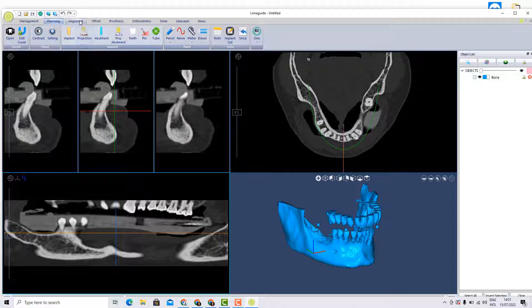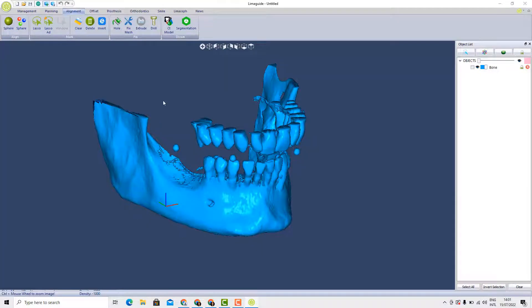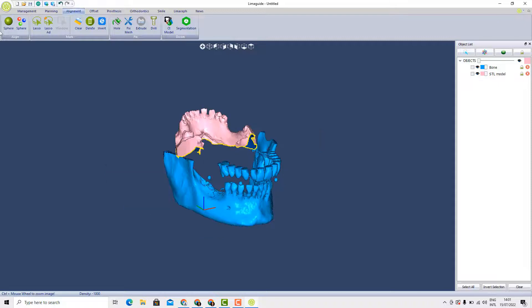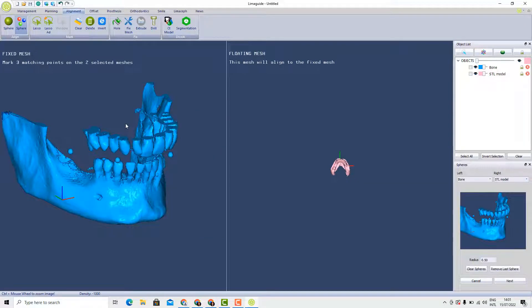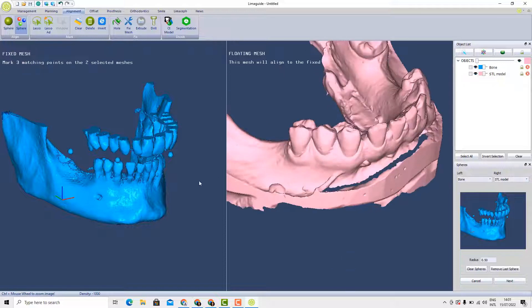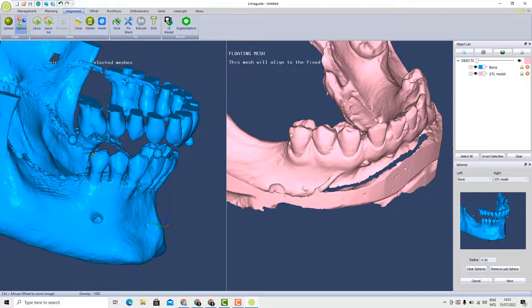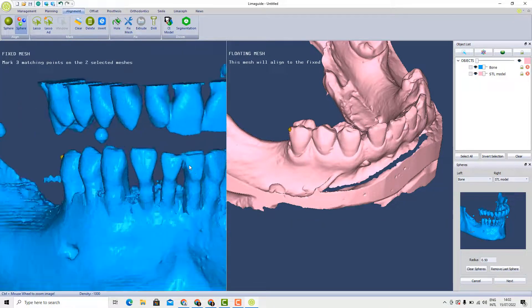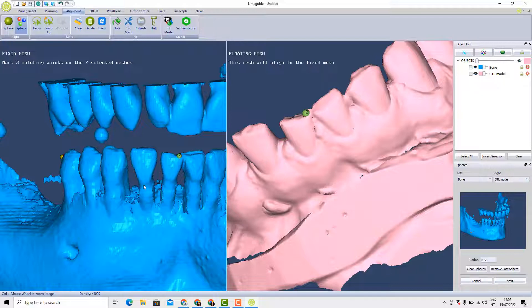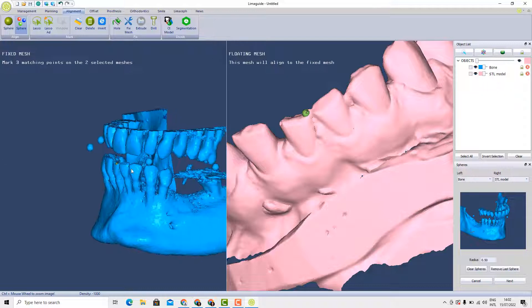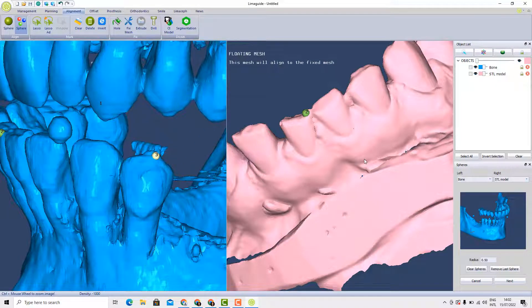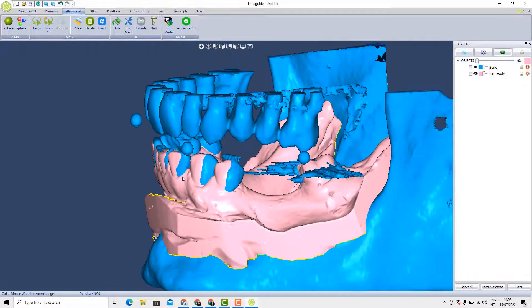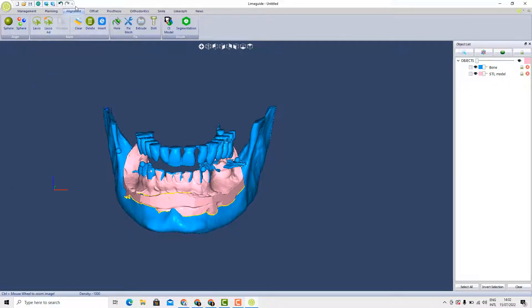The alignment section we can see, for example, the sphere. I'm gonna import an STL and do a quick example. For example, here if I press on the sphere button, it's to align that DICOM with the STL. I'm gonna zoom in here. We go, for example, I'm gonna press on the teeth to be able to align them. Here I'm gonna place another dot, for example. And we press the next button. So here I'm gonna have the alignment of our STL with the DICOM.